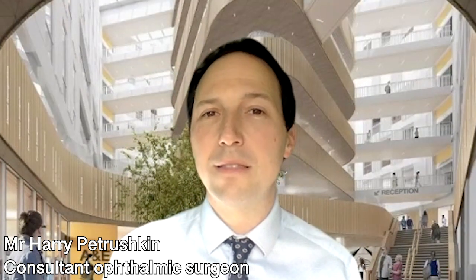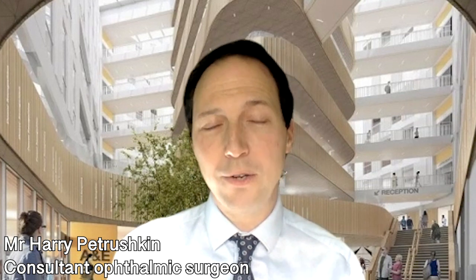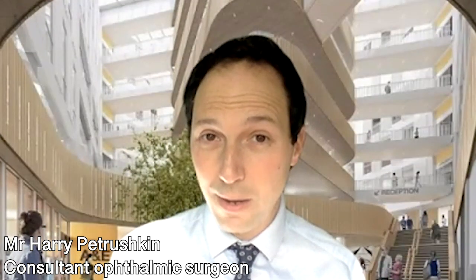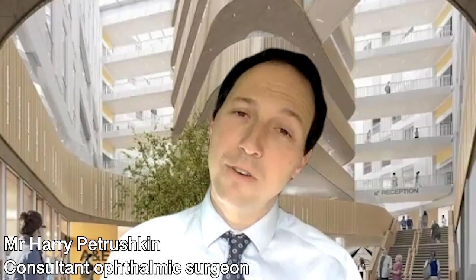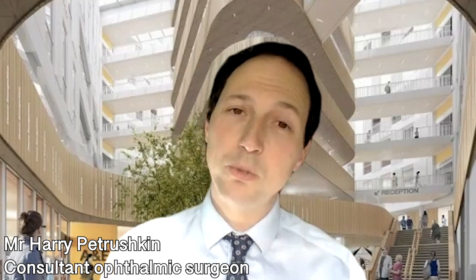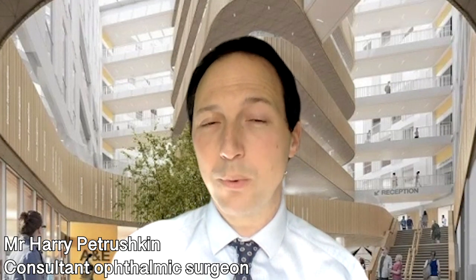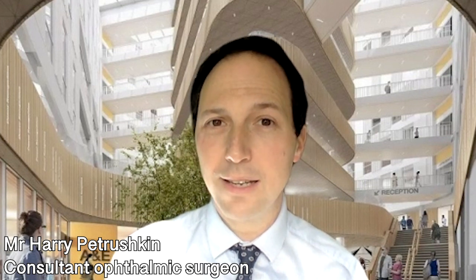If, let's say, you've made the choice to remain short-sighted, and so we put lenses in your eye that mean that you can have reading vision, but actually you've decided a year down the line that you'd rather have distance vision, well, firstly, you can wear glasses and that would correct it. Secondly, you could wear contact lenses and that would correct it. But if neither of those options appeal to you, then it would be possible to have laser eye surgery, which would not touch the lenses themselves, but would change the shape of your cornea to give you that distance vision back. So there are things that we can do, but really I put a lot of emphasis on choosing the right lens at the start.